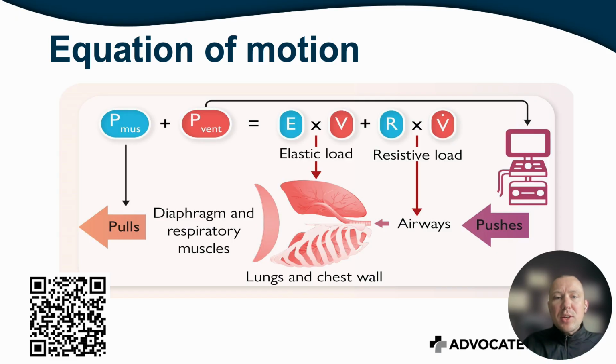So the pressure that the ventilator needs to generate on the left side in order to overcome the elastic and resistive load of the patient's body will be mainly through the volume that is expanding alveoli and interacting with the elastic load of the patient's body, and the flow, which would interact with the resistive load of the mechanical ventilatory circuit.